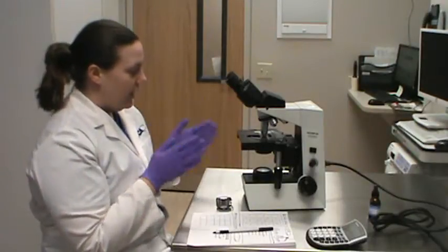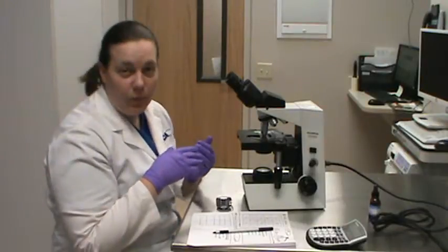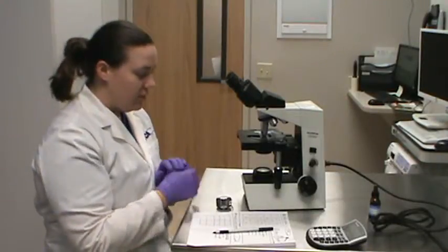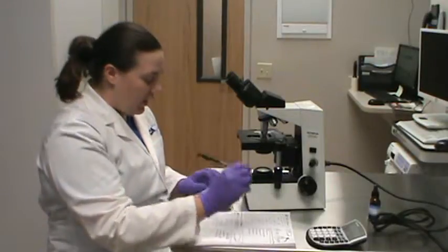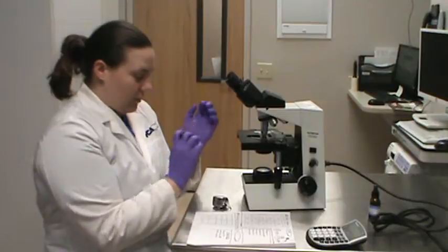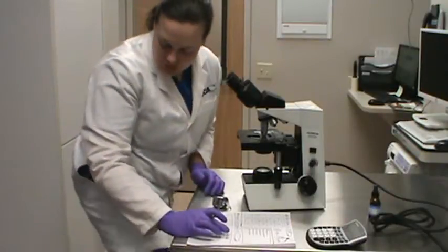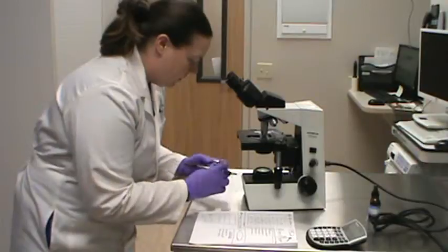Then we're going to take a peek under our 100 times oil immersion lens. And again, we're in our monolayer right now, which is our starting point for where we want to start counting our white blood cells. And again, we want to count 100 white blood cells. So any of these that I see, I'm going to make a tally, and I'm also going to use this counter to help me count as well. So it might be quiet for a little bit because I'm going to be focusing on trying to count 100 white blood cells. I'm also just going to stand because I keep sitting on my foot and making my foot go numb.